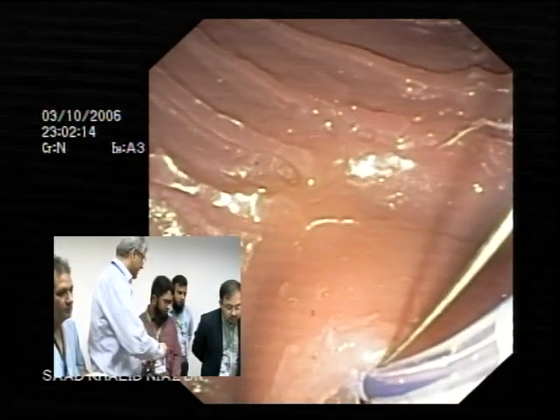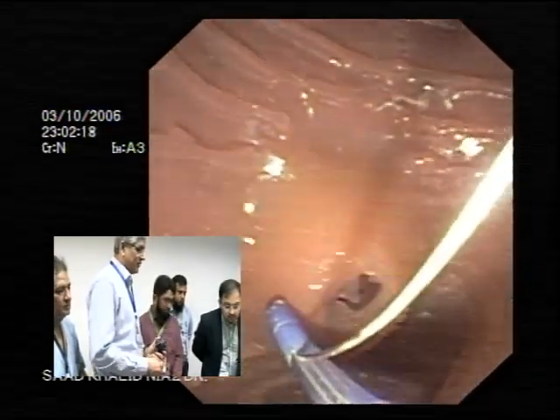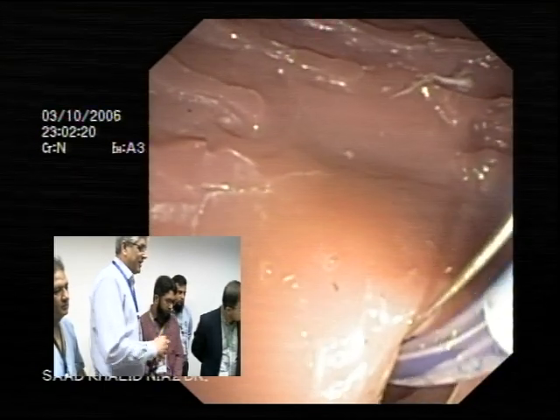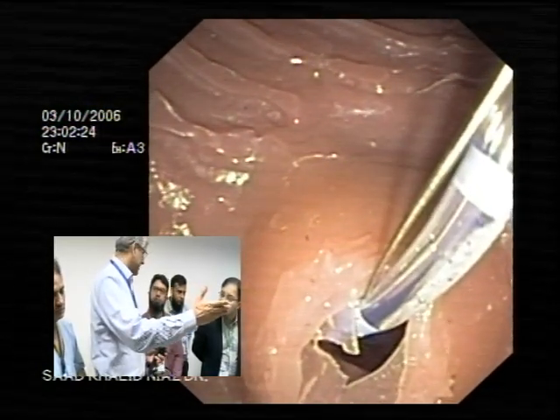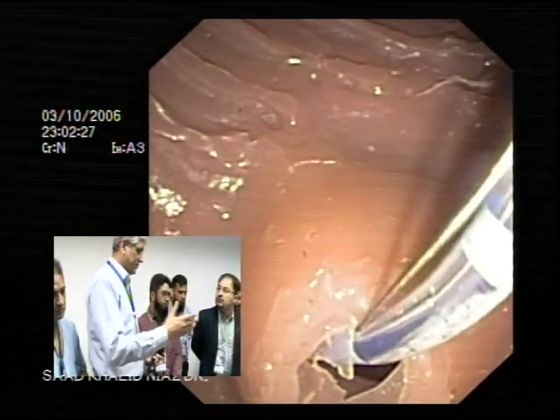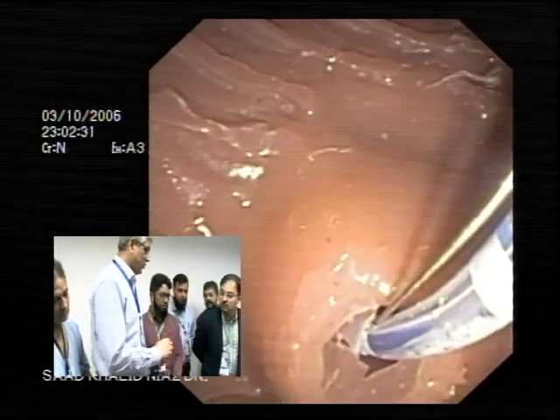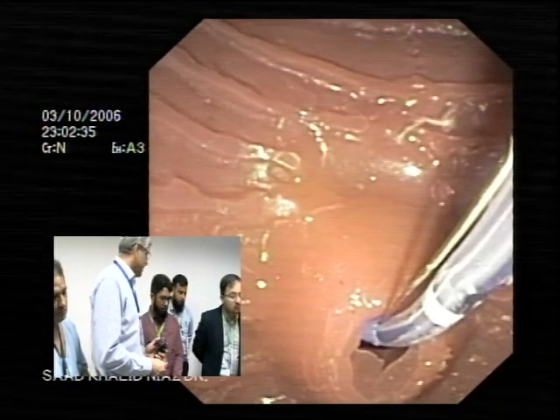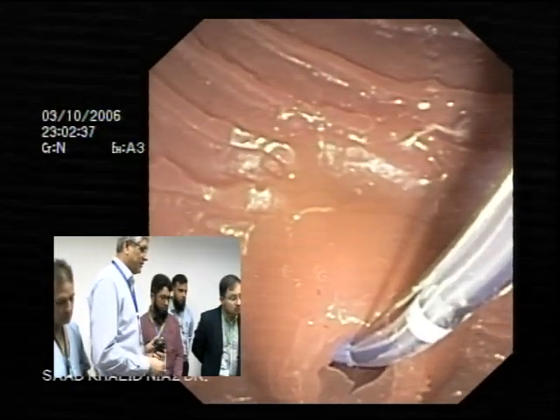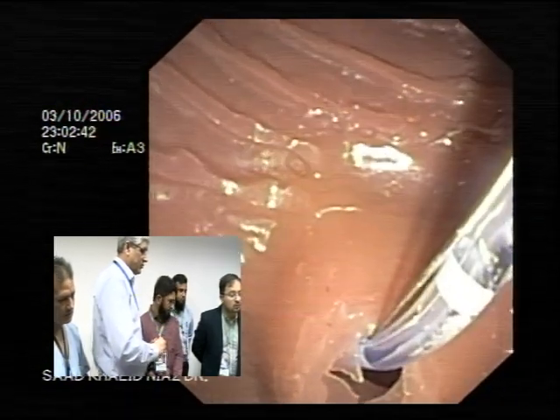And that's what I did with my small wheel. And this is good because I needed to get into the right position for going towards the CBD. So what this tells you is that you have that option of using the small wheel as well, if you want to. I'm not sure if I'm in, but this is what I would do. Big bow karna beta, Akram, bow, more.